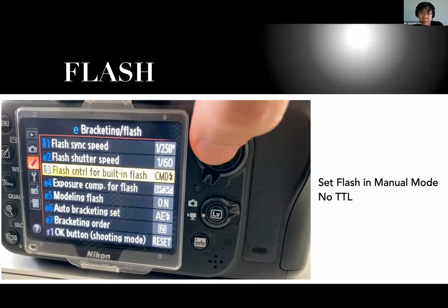So you want to make sure you keep consistency using the same settings with the same reference cards and shade guides, and you keep repeating that with the ceramist that you work with, because otherwise, if you don't have consistency and you keep changing the settings, your ceramist cannot learn your style, and you will always have inconsistency in your results.